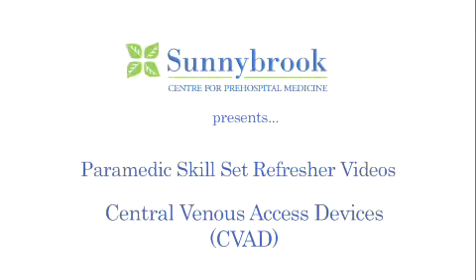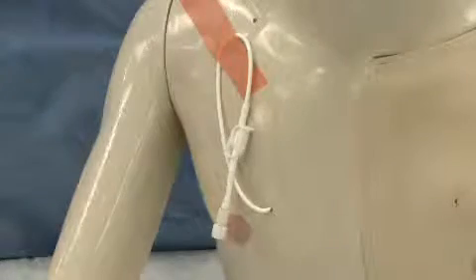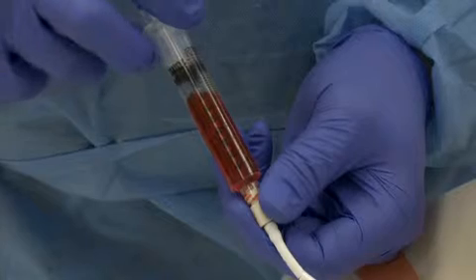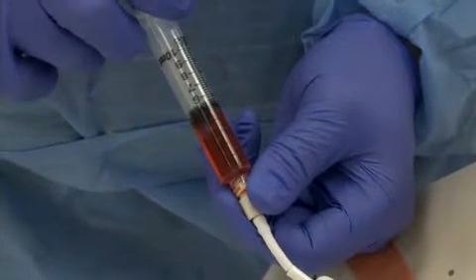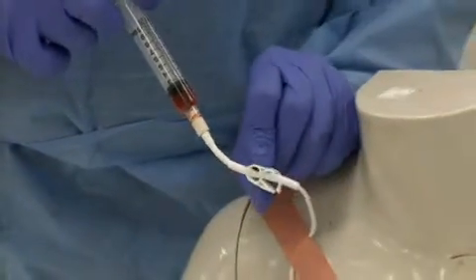Central Venous Access Devices, CVADs. The CVAD may be accessed in the event that you have a patient in an arrest or near arrest state who requires either IV fluids or medications, and you are unable to acquire peripheral IV access.